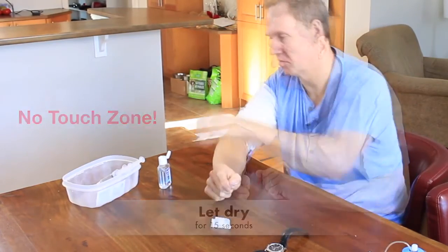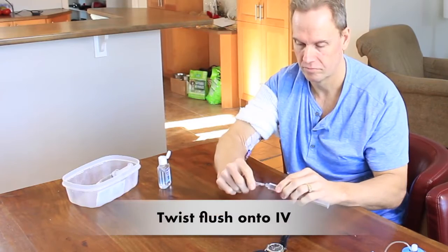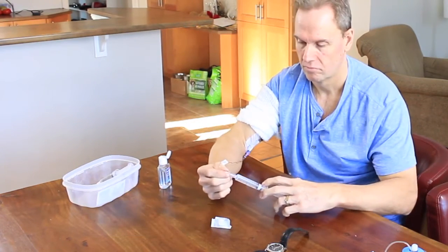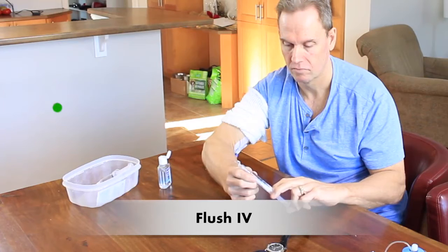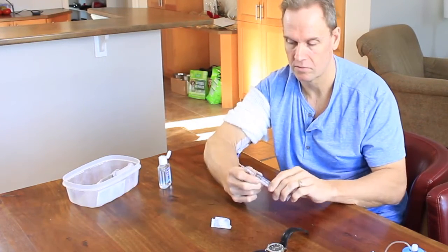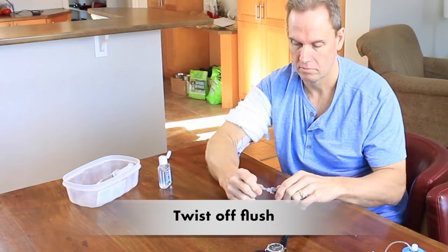Take the cap off the flush and push and twist the flush onto the IV cap. Now you're going to push up on the plunger, push, stop, push, stop, push, stop, until the flush is empty. Now twist off the flush, making sure the cap stays on the end of the tubing.